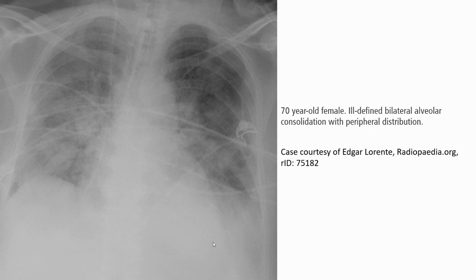Another case of ARDS in a 70-year-old female. Her chest radiograph shows ill-defined bilateral alveolar consolidation with peripheral distribution.